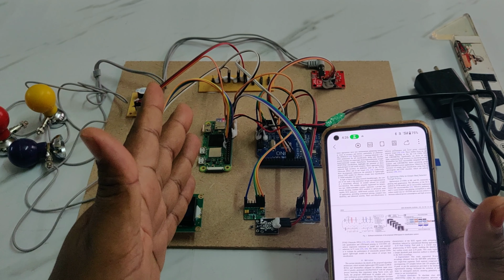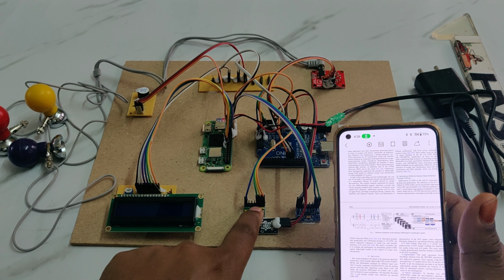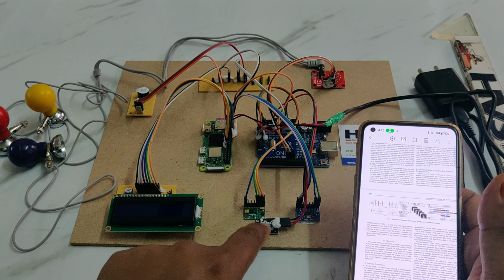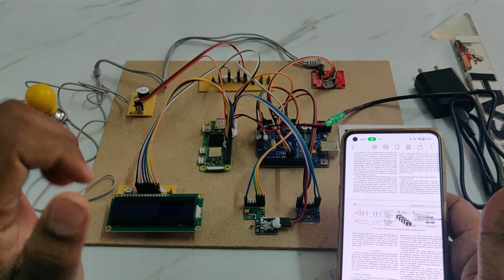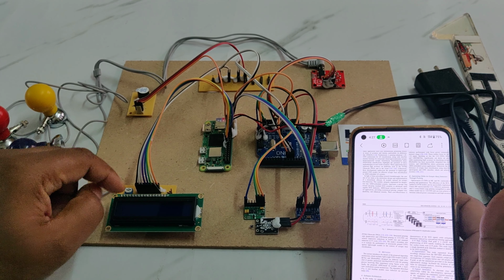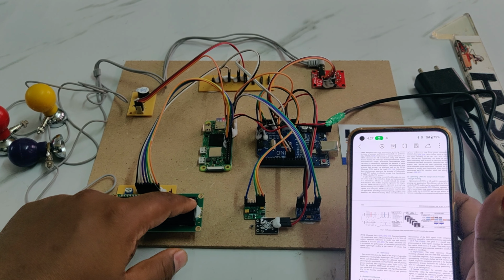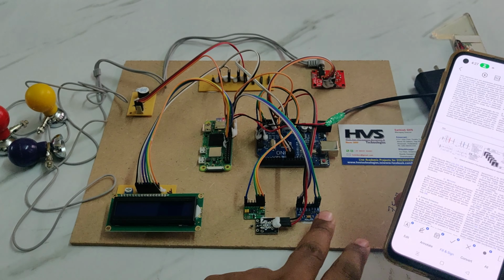This is the main input, and it will estimate the same with our heart rate and SpO2 along with the temperature. These sensors along with the ECG detect and classify the diseases, and the person's disease will be displayed on the 16x2 LCD screen. This is for the disease classification using the CNN. And the next, extra, is fall detection.